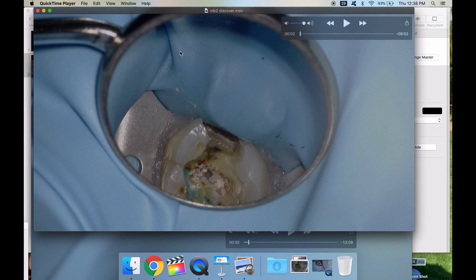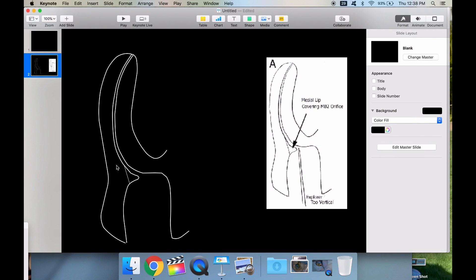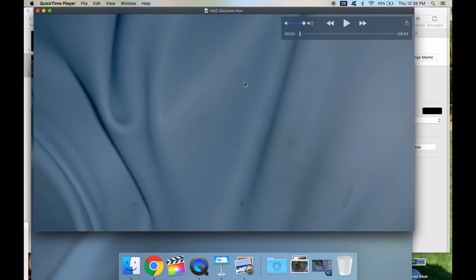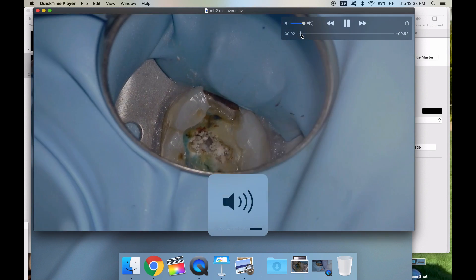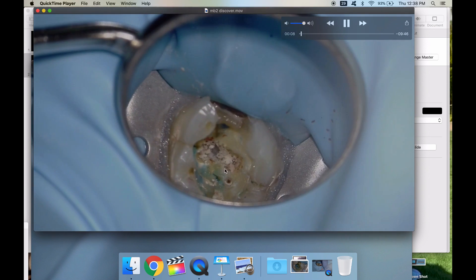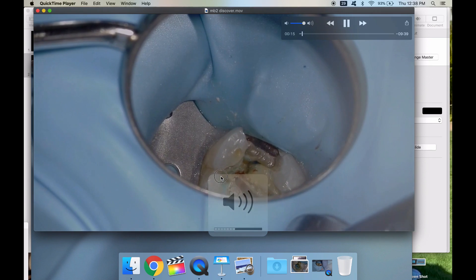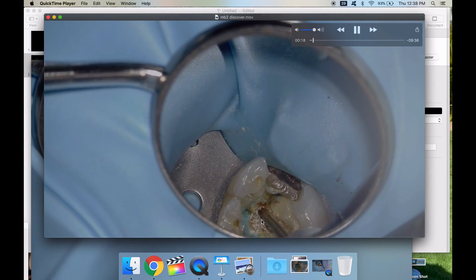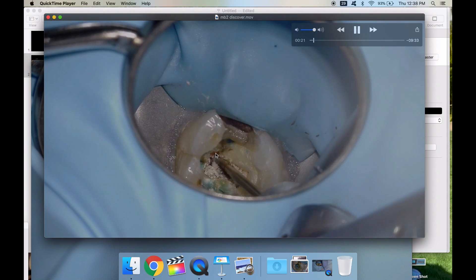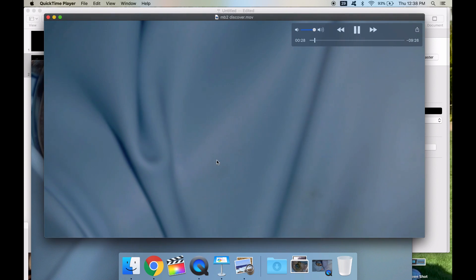One of the big things I really wanted to talk about was troughing for MB2. When you're troughing for MB2, if this is the mesiobuccal root and here's the access opening, there's this little mesial lip covering the MB orifice — it's always like that. Watch for that in this video. I did more troughing along this mesial wall for MB2, usually looking for approximately 1 to 1.8 millimeters away from the mesiobuccal one canal.